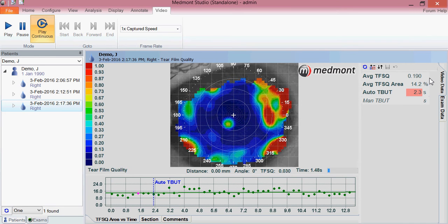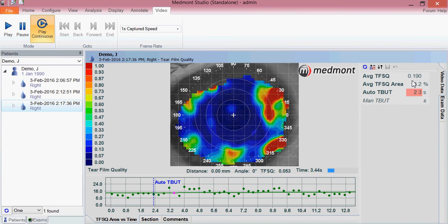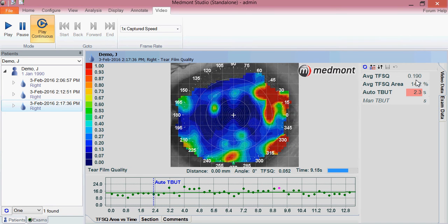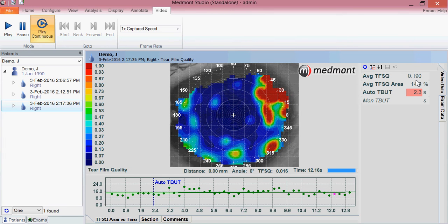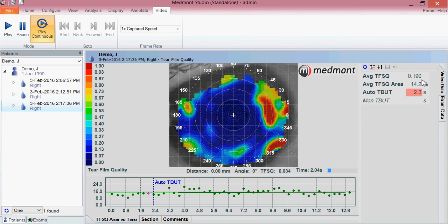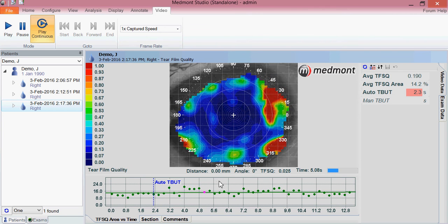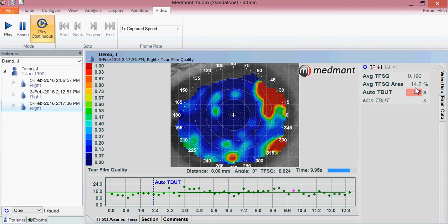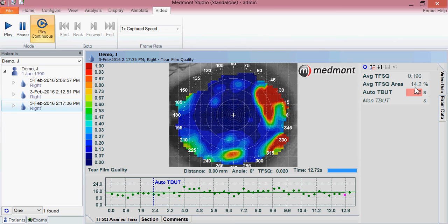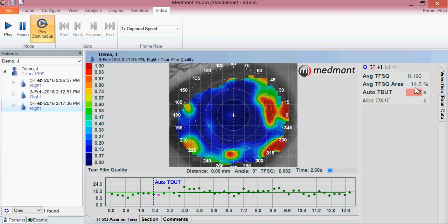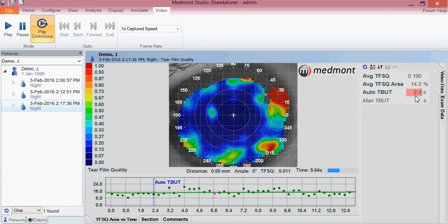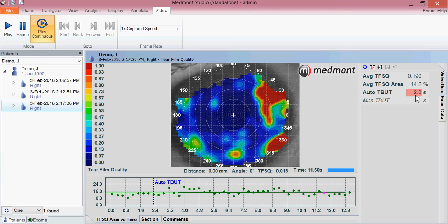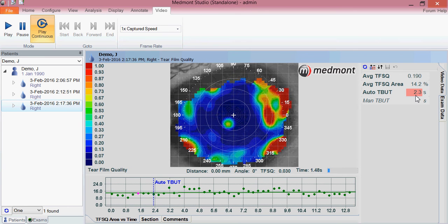If we go to the top right hand corner, we can look at the average TFSQ: 0.190. Dry eye would be considered any value over 0.1, so this patient would be over the dry eye threshold — that's taking the average of all these data points together. Next, you can look at the average TFSQ area believed to be in breakup: 14.2% of the measured area. And lastly, we have a 2.3 second tear breakup time. So all of our indices are indicating that we have a relatively dry eye patient.